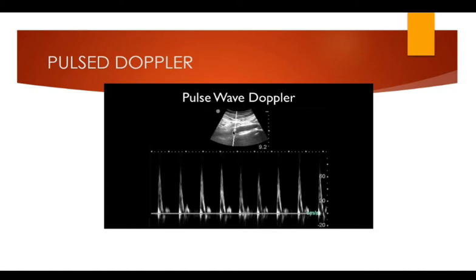And all we're doing is once again, we've ignored all the rest of the image, and we're just over that little sample gate. So all we're doing is seeing what's happening right there at that tiny, tiny spot over time. And we can see that we have placed this over the aorta. We get that nice flow right through there, which is typical of an arterial type flow, especially the aorta at these velocities. So that's just showing you your scale, which I already pointed out, and then the baseline here. And those can be adjusted. Sometimes if you set your scale too low, you will see what's called aliasing, and it will come around to the other side.